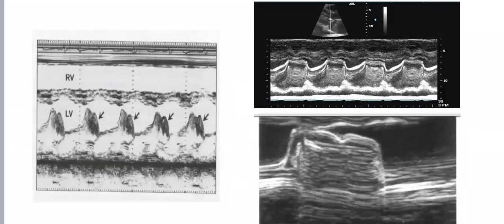So that one tends to be a smaller mass, that is vegetation, and the one on the right is a myxoma, a big mass. So when it goes down, it prolapses into the plane of the mitral and fills the entire space, okay? While vegetation, because it's much smaller than the space between the two leaflets, that's what you get, okay?